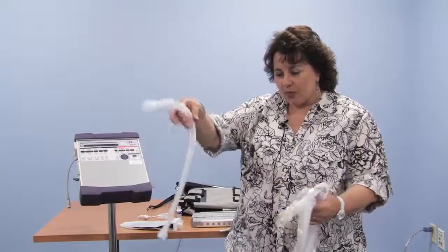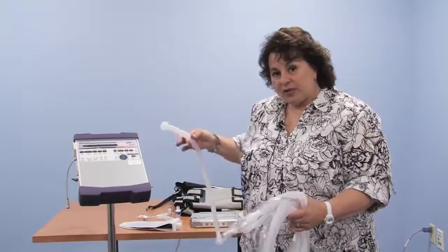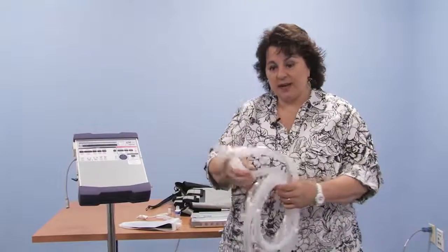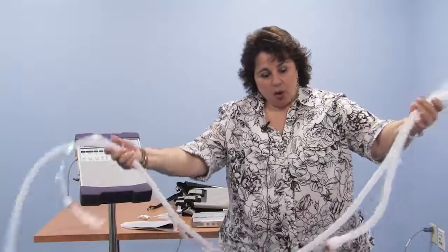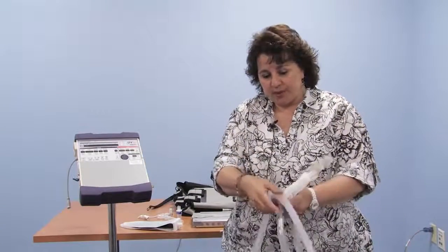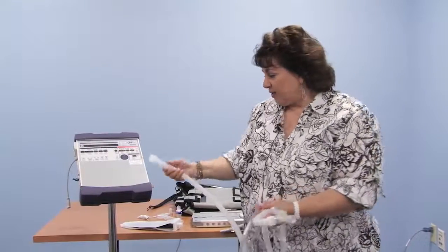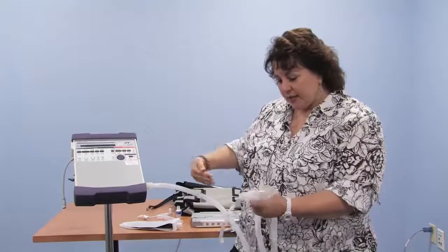The circuit does come with the short piece, but we're not going to be using it. We're not going to be sending the air from the machine to the humidifier, so we won't be using that piece now. We have the same circuit that you saw earlier. It's all white instead of blue and white because it has no wires in it, so there's no heated portion. So we're going to connect the large hose to the outlet of the machine. We're not going through the humidifier and the heating system.